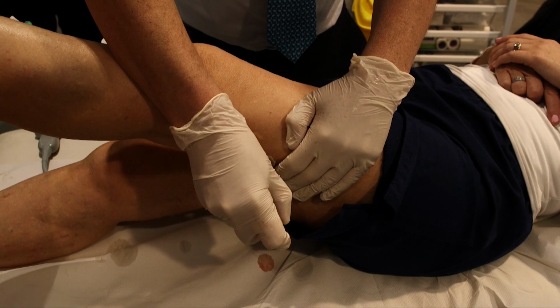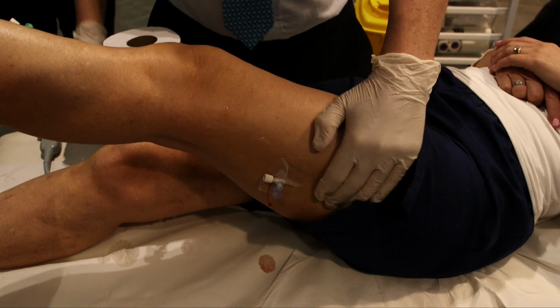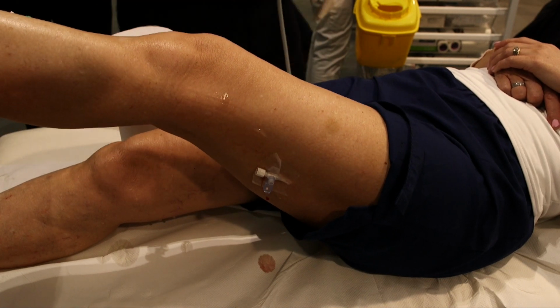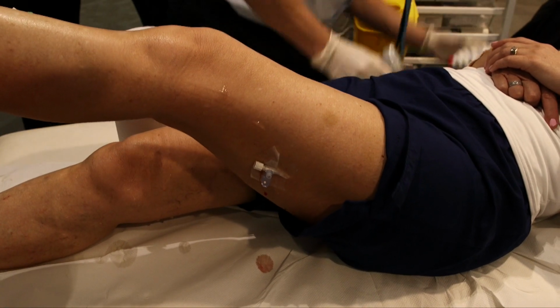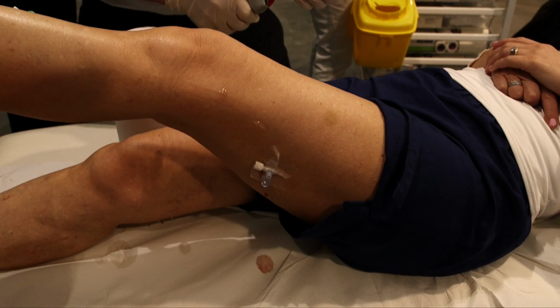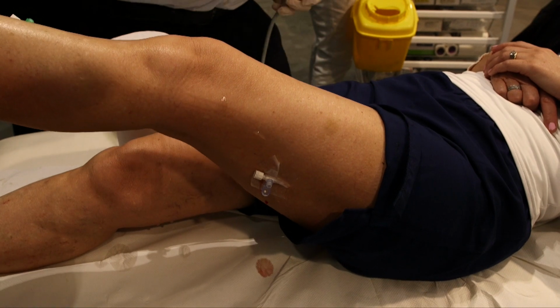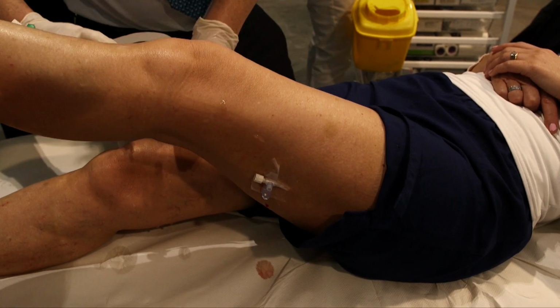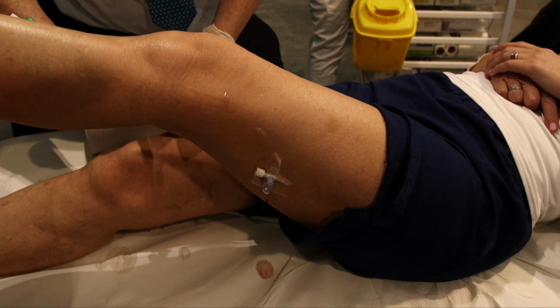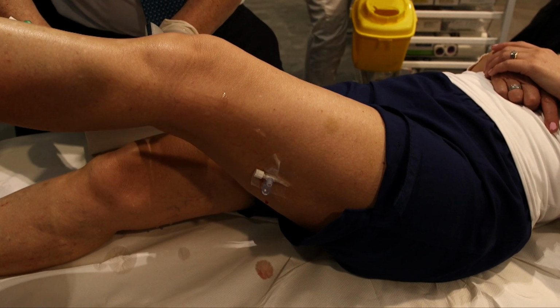And so now most veins will be filled with foam. So you can waggle your foot up and down again there. Thanks. And I'm going to put some 3% in here. We'll make this the last one actually, Kate, because we've already put quite a lot of foam in. So here is some 3% foam.